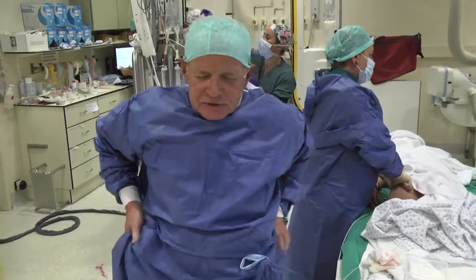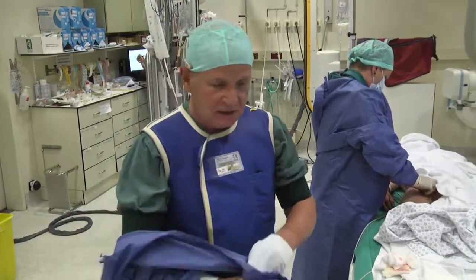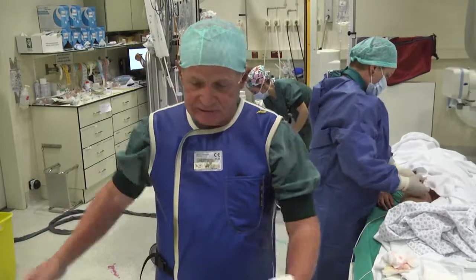Well, to be honest, this was my 4th new Ensemble system. So I'm an old guy dating from the days that there were no markers.